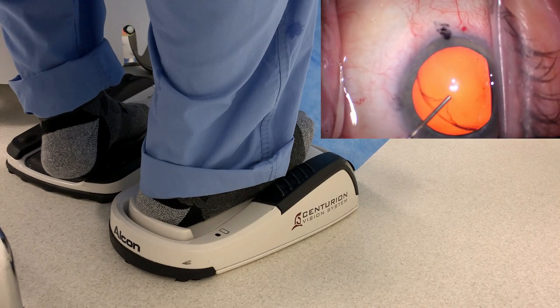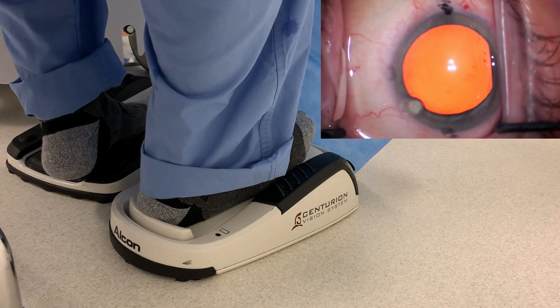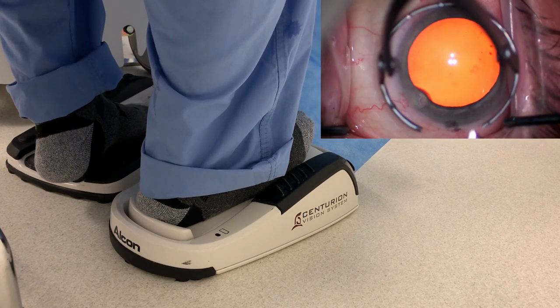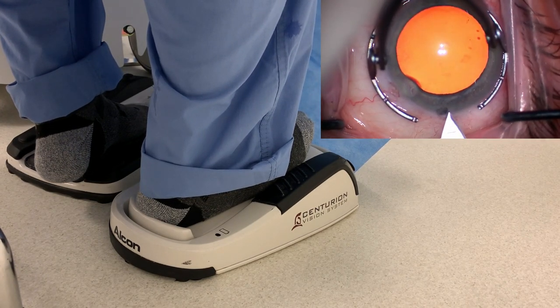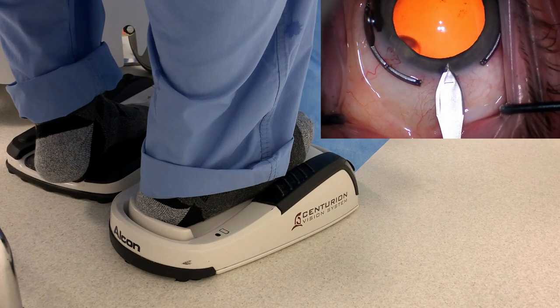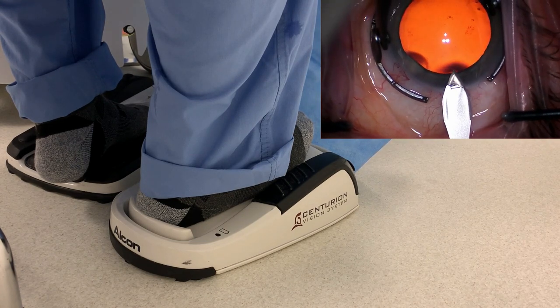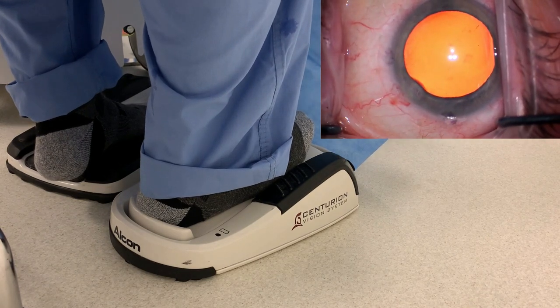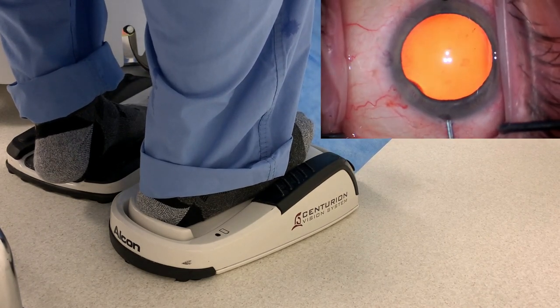Beginning of the case, there's not a lot of foot action. We're just making our paracentesis. We filled the eye with viscoelastic. Here comes the main incision — the feet aren't really doing much. Notice how the left foot is sitting on the footrest between the focus and the zoom, and the right foot's on the phaco pedal, but not actively depressing it.